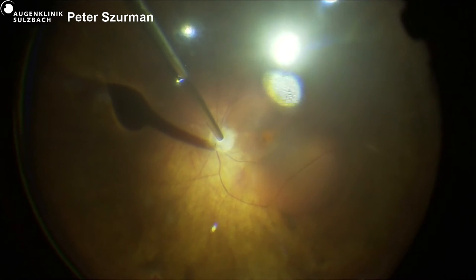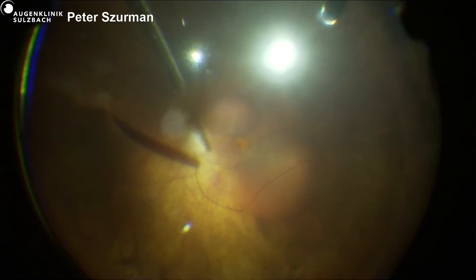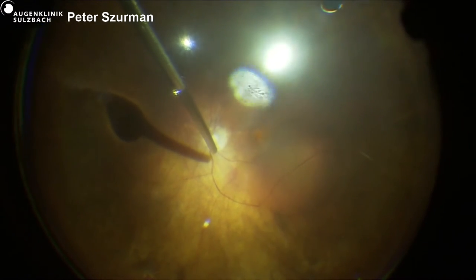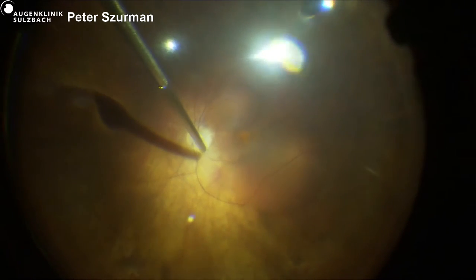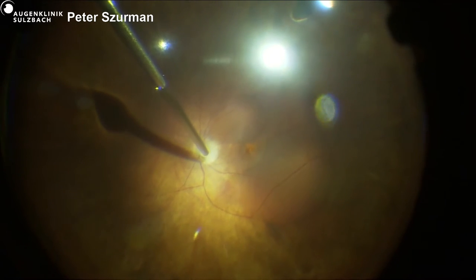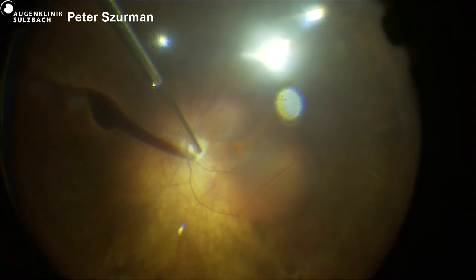If we could have an exchange to room two, please. Yeah, so the room two. So Peter. Yeah, the decisive steps have already been done. And we just do a fluid air exchange and fill it with gas. That's it, basically. The fluid itself.